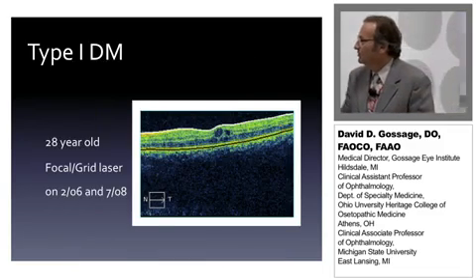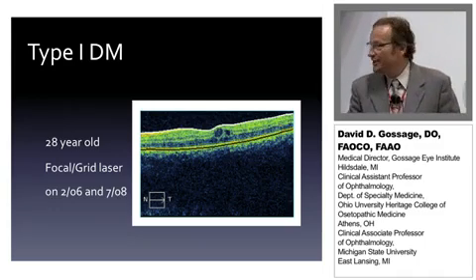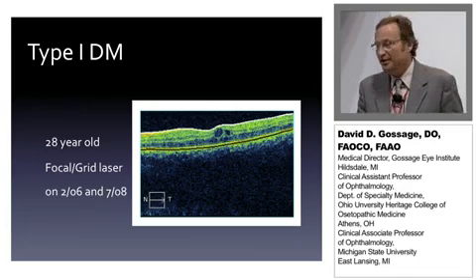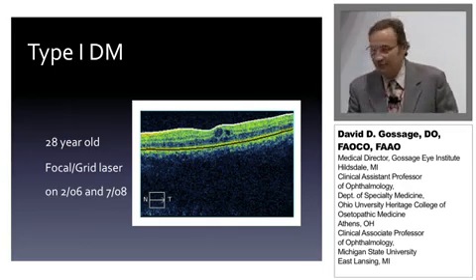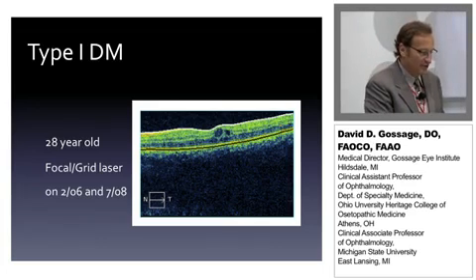So I'll just go through a couple of cases. This was a 28-year-old who had type 1 diabetes. They've had some previous focal grid laser treatments back in February of 06 and also July of 08. And the OCT demonstrates the macular edema present.